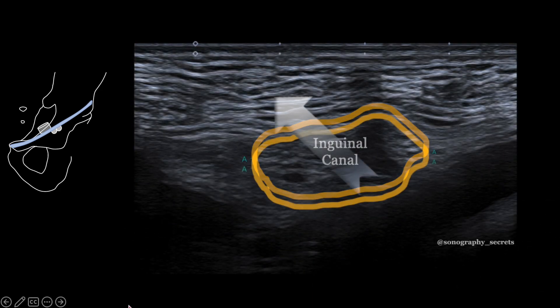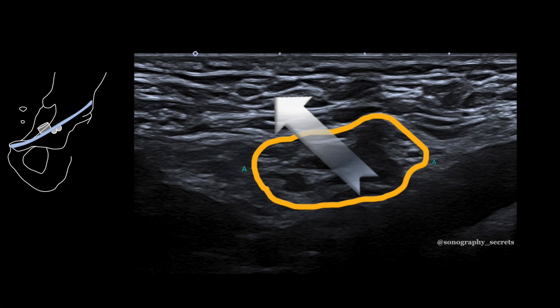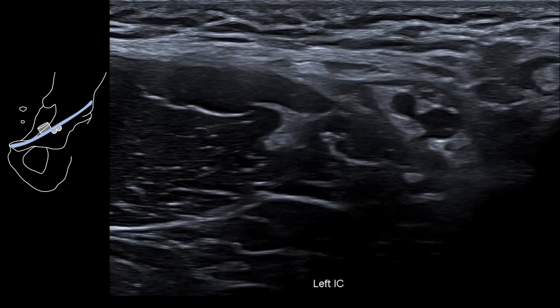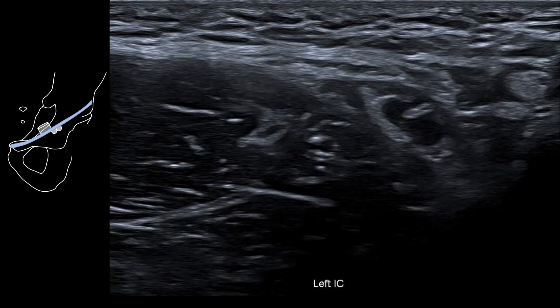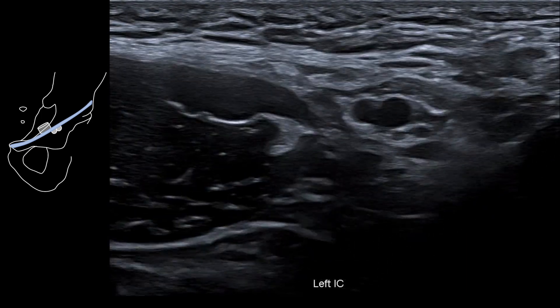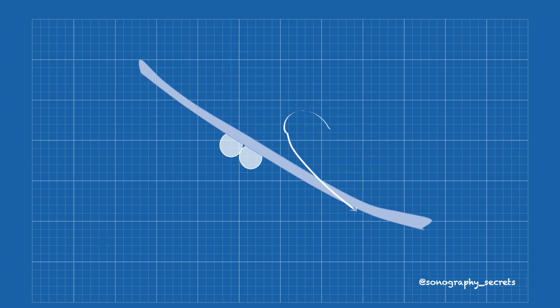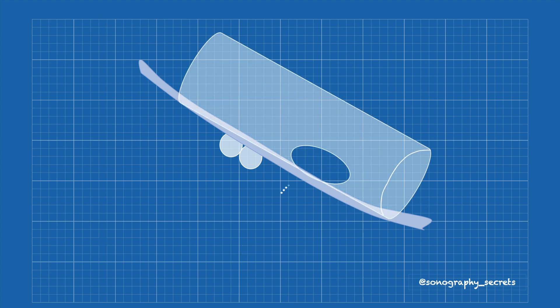We get the patient to strain or Valsalva, and we're looking for something to push through and distend the canal. Movement either side is normal, but if we have movement through the canal, then we have a hernia. From here, it's simply a matter of determining whether this comes lateral to the epigastric — that is, we have an indirect inguinal hernia — or medial to the epigastric, that is, a direct inguinal hernia.